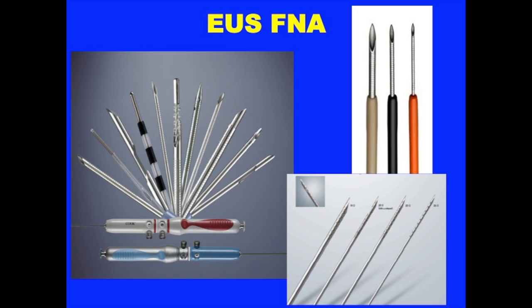For many of these, they are actually core needles, like this one from the Cook company, and they allow us to get more toward histopathology, so it can be more helpful. And I think this will play a role too as we become more focused on the responsiveness of patients' tumor to different types of chemotherapeutic agents, and we become more designer, as they have, for example, in lung cancer.